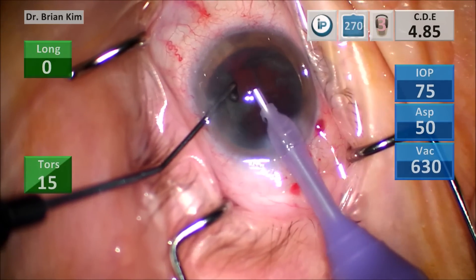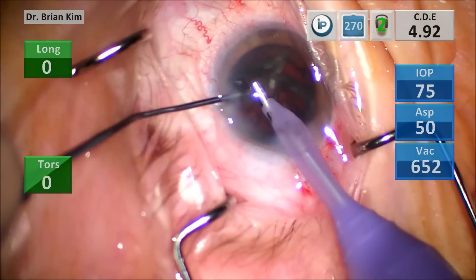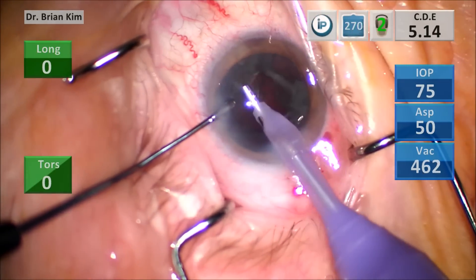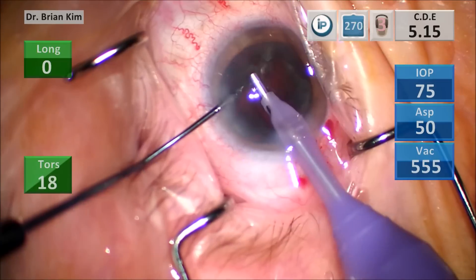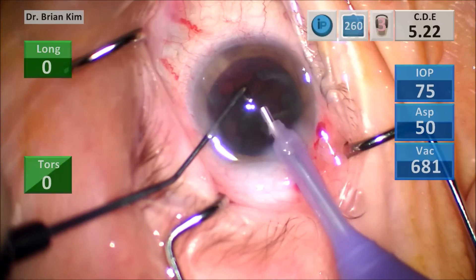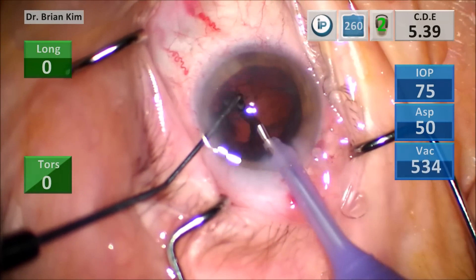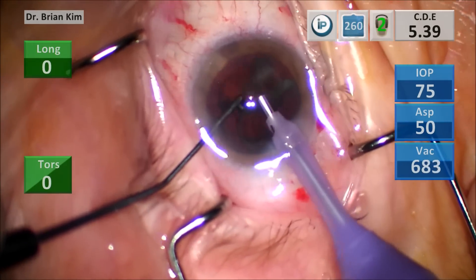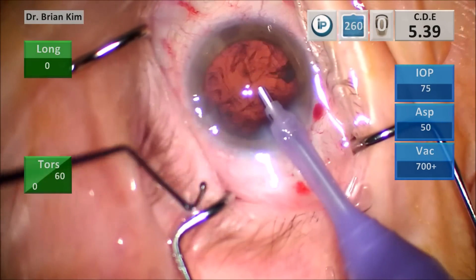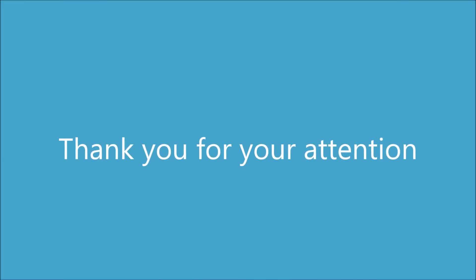I hope that you can see with my FacoChop technique, chopping does not require ultrasound or vacuum. That's an important principle because when I learned FacoChop, we were taught to bury the FacoTip into the lens as we chop — it was thought that we can have better leverage by holding it with vacuum and ultrasound. But in my opinion, that's unnecessary and it's risky. As you can see, this works quite well, and I hope that you can apply this for your own surgeries. Thank you for your attention.